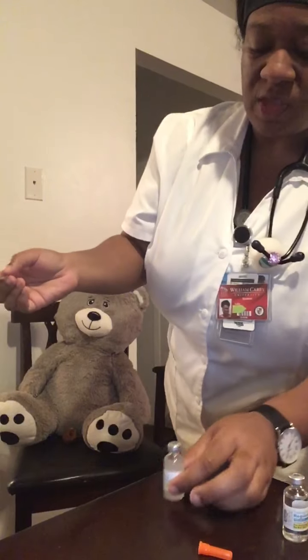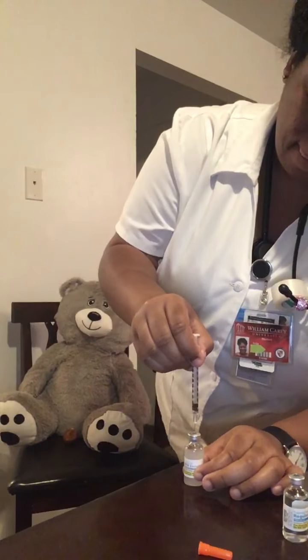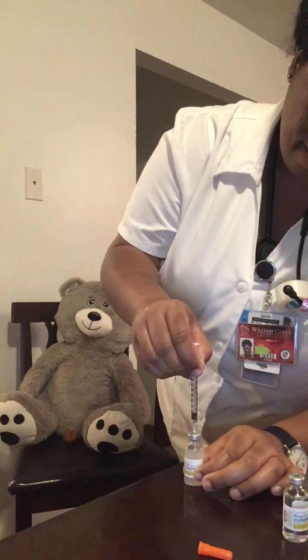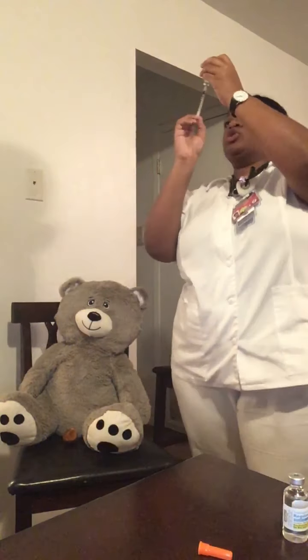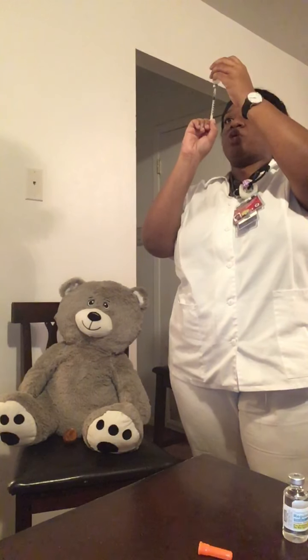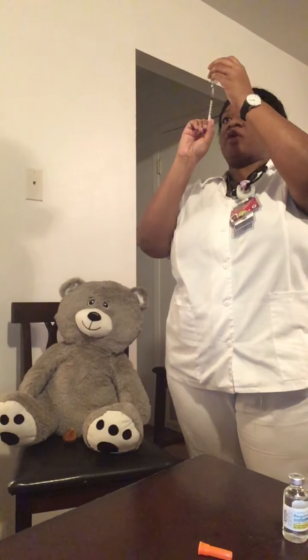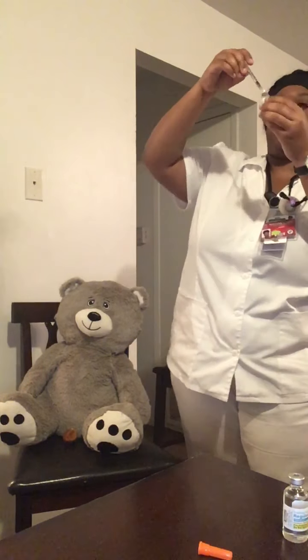And then we're going to get 16 of my NPH, and this is going to give me a total of 22 units. So we have our 22 units here, being sure not to inject anything back into this vial.